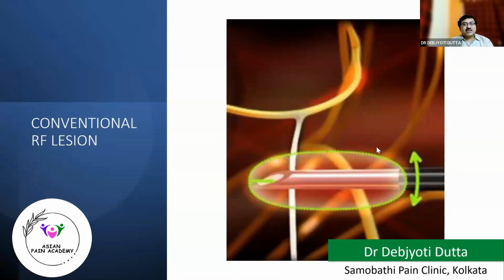Yes. Initially, when the tip is being heated, the tissues close to the tip will have their temperature increasing. So if we have set the machine at 80 degrees Celsius, the tissue close to the tip will reach the desired temperature first, that means 80 degrees Celsius. So it is the needle and this first layer of tissues that will reach 80 degrees Celsius.